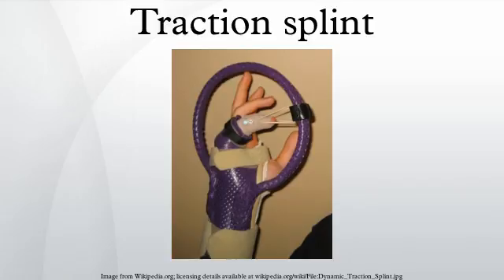All agree that traction splints should only be applied when there are no fractures of the pelvis or knee and the fracture has not broken through the skin with bone visible. Use of a traction splint while other fractures in the leg exist will cause the weaker fracture side to pull apart and not the targeted femur fracture.